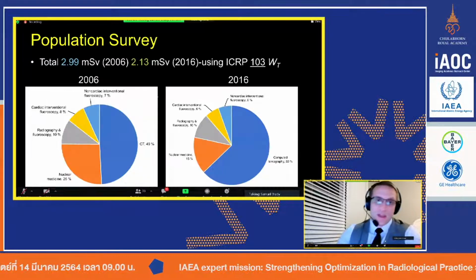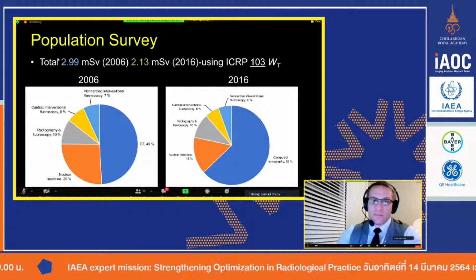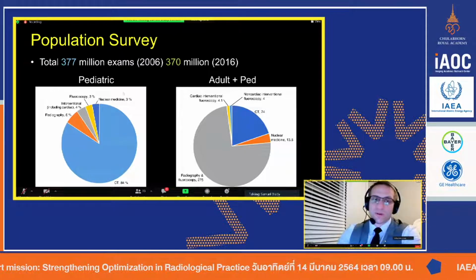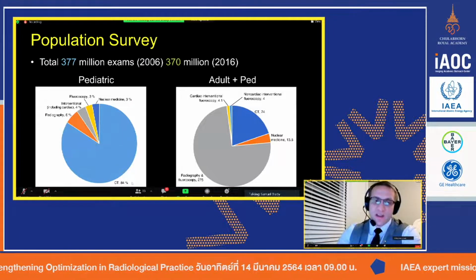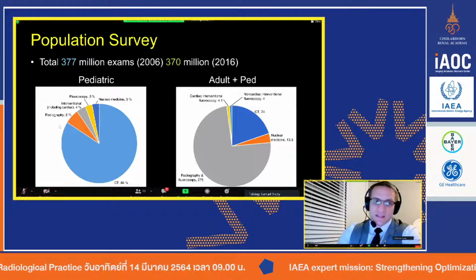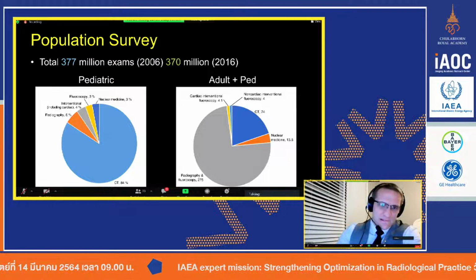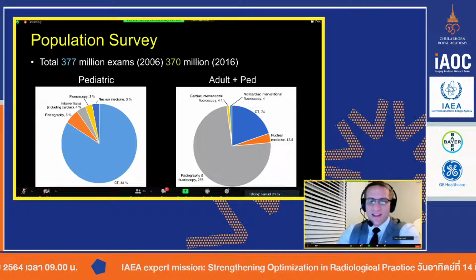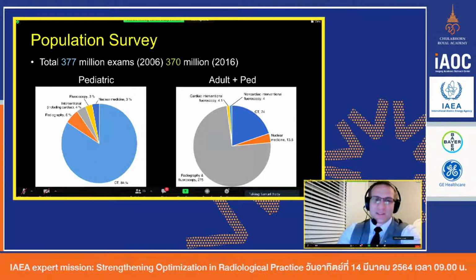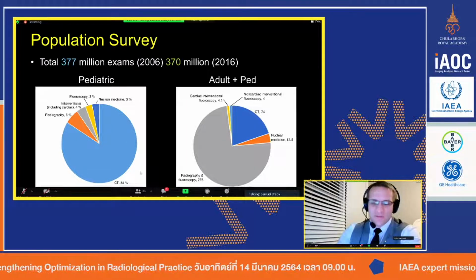All right, so when you look at the dose here, I'm sorry, I actually misspoke. I said dose burden. My sincere apologies. This isn't dose burden, this is usage. In kids, no, I'm sorry. I'm all confused. My apologies. What I said was correct. This is dose burden. 84% of the radiation dose in kids comes from CT.